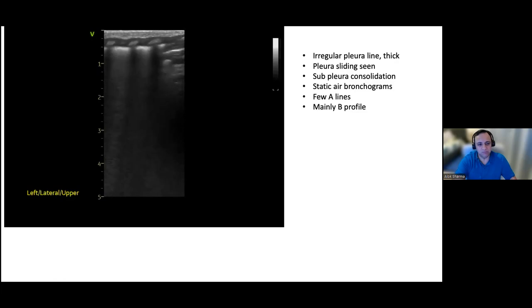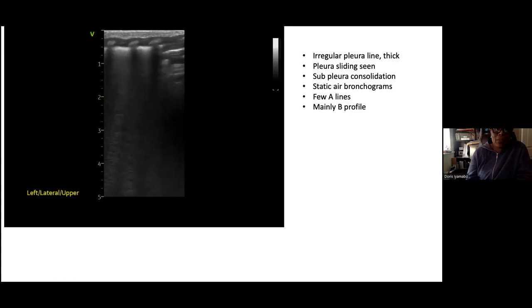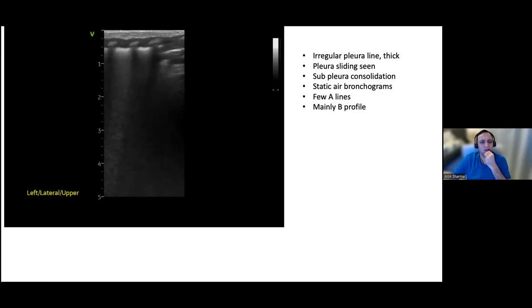Have you been able to go a little bit lower down and put Doppler on it? I'm still struggling to make the Doppler work. When I put it on, it's low speckling, so I wasn't sure I could really trust it. I've not gotten that Doppler bit right yet, so I'm still working on it. No problems.